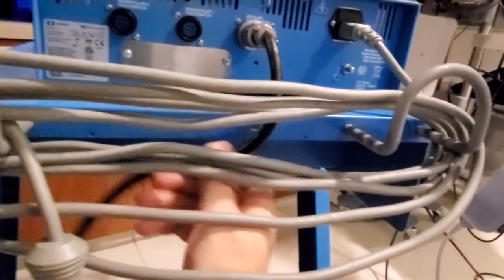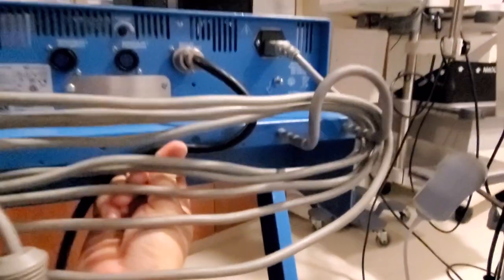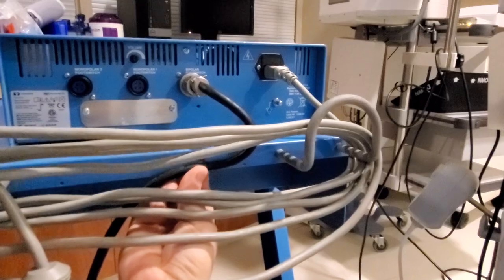So what we try to do is curve the cable up just a little bit so that it takes strain right off of this point right here. And what I do is I bring the cable up. You can see that there's a beautiful little hole right there.